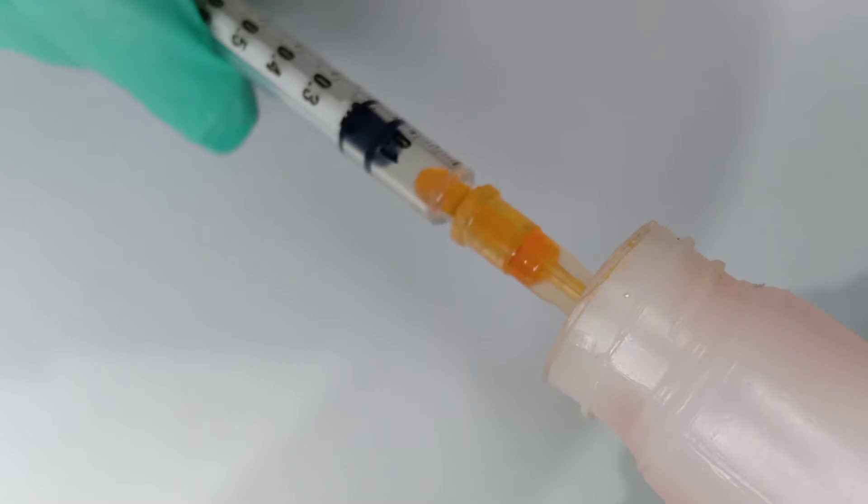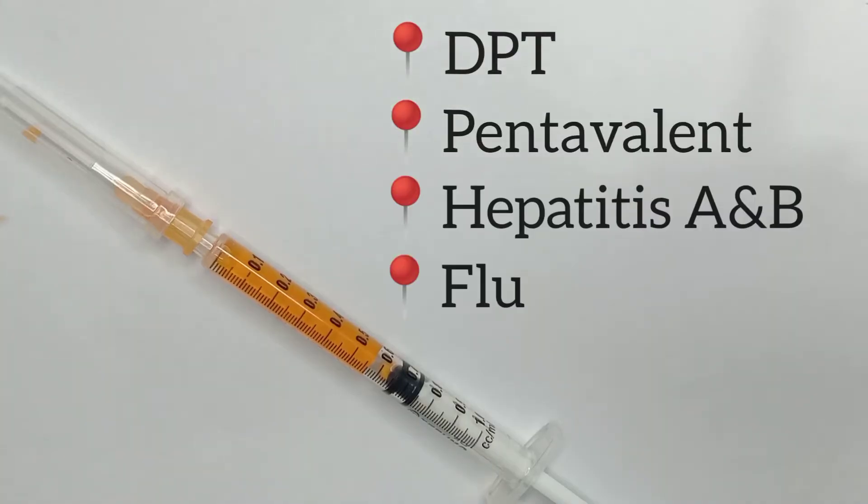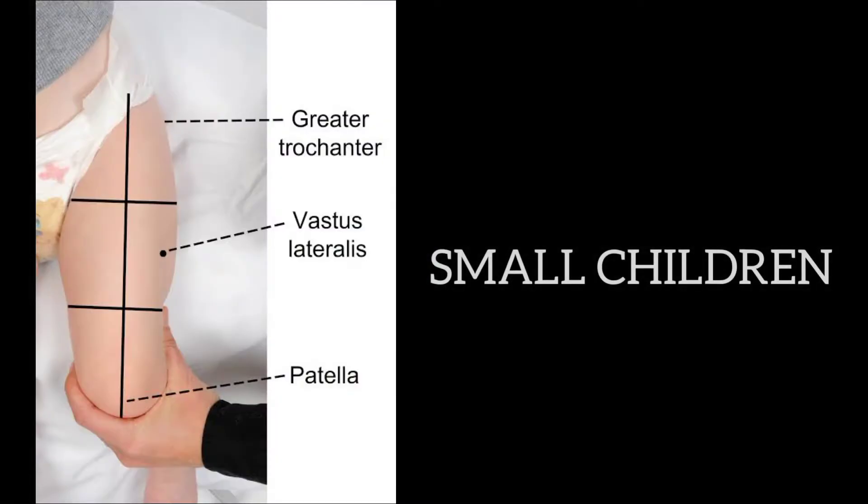Intramuscular technique is commonly used for vaccines such as DPT, pentavalent, hepatitis A and B, and flu vaccine. For smaller children, the injection site will be in the vastus lateralis muscle, which is located at the anterior lateral aspect of the upper thigh.